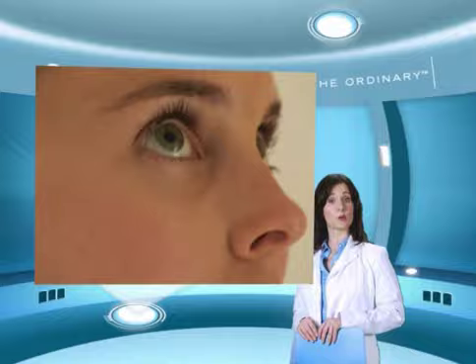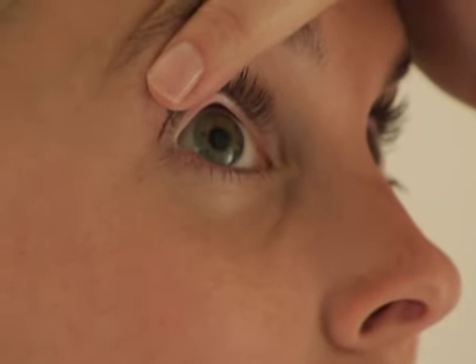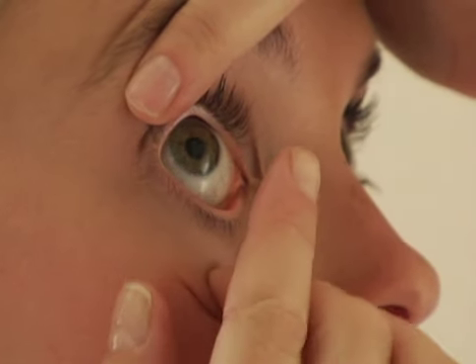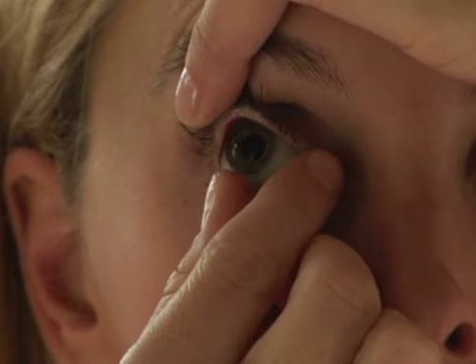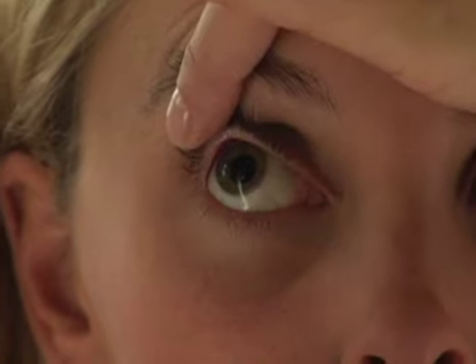Looking upwards, hold up your upper eyelid and eyelashes to avoid blinking with the index finger of your left hand. Pull down your bottom eyelid using the middle finger of your right hand. With the index finger of your right hand, touch the lower edge of the contact lens, then slide the lens down to the lower white part of the eye. Gently squeeze the lens between your right thumb and index finger and remove it from your eye without any excessive folding.